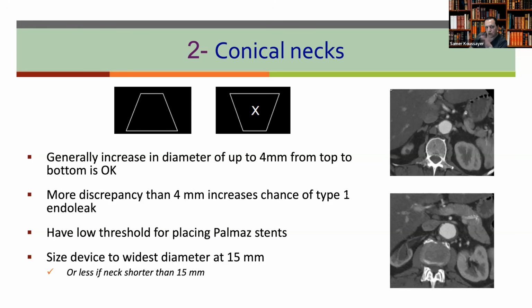But always go with the oversize, and always be sure that at least the graft will touch the wall for at least 10 to 15 millimeters. If you have an angulation, maybe you need 20 millimeters touching the wall. All right?